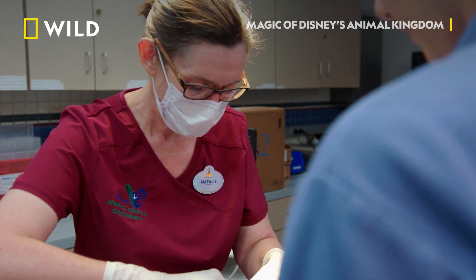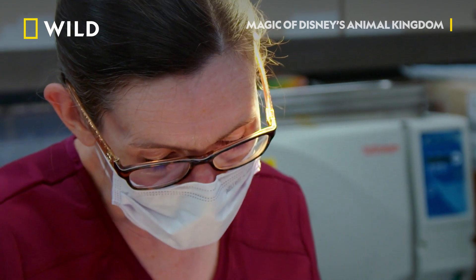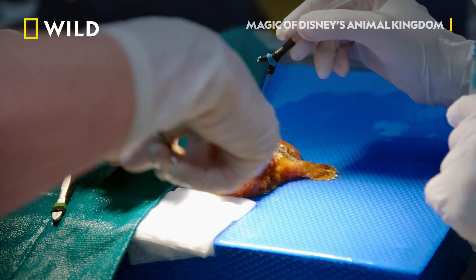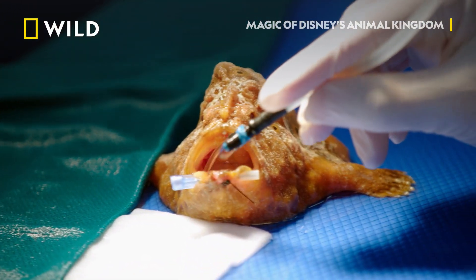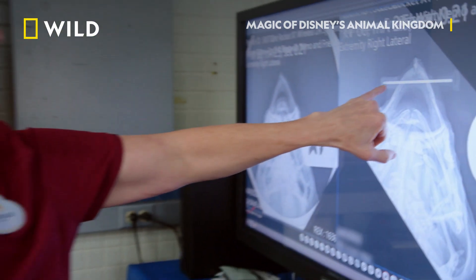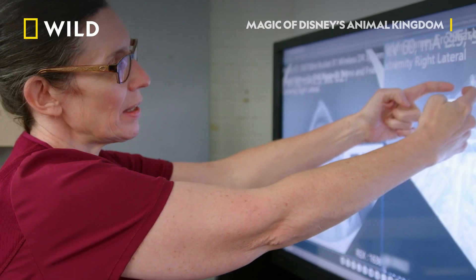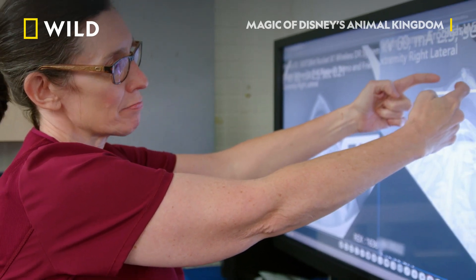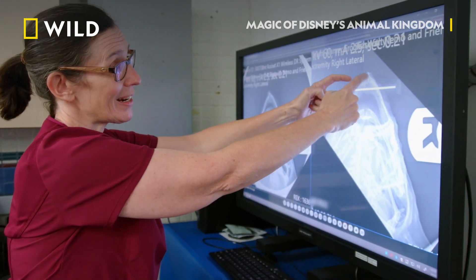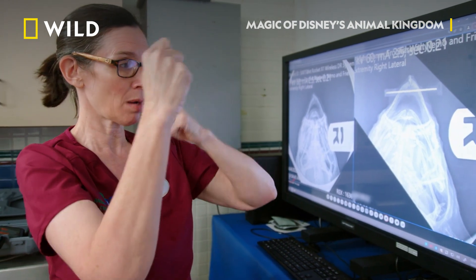I have to be super careful. And he's soft. So this is ultimately the bar that we put in using a syringe needle. Right now, what I'm hoping for is all those crystals — those bone graft crystals — will create a callus, and that will seal it together so that it's not wobbling.